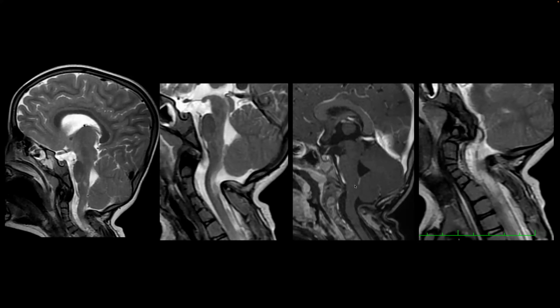I agree. But if you see on the T1 out here, this area does not show hypointensity. It is isointense, or slightly hypointense. There should have been a cleft out here also in this portion. Dr. Nihaal, do you see those sagittal changes that we are talking about in the cord, even in the axials? Then it will be corroborating.